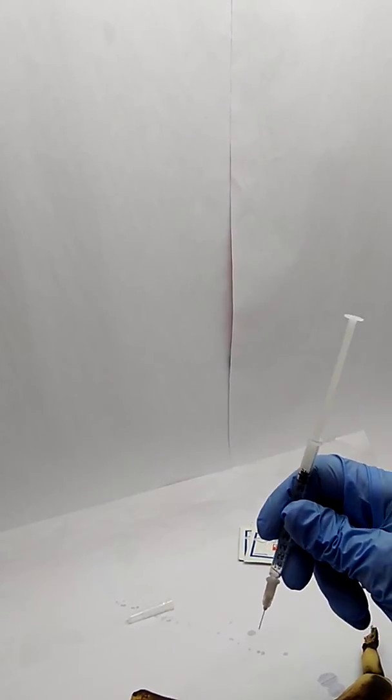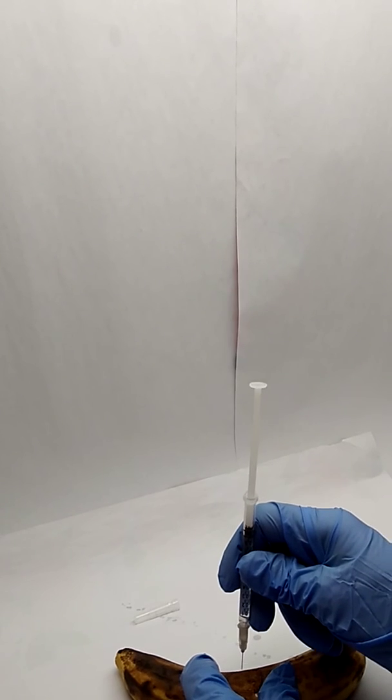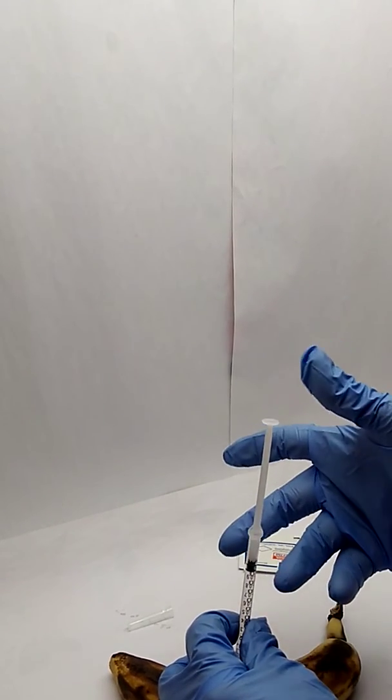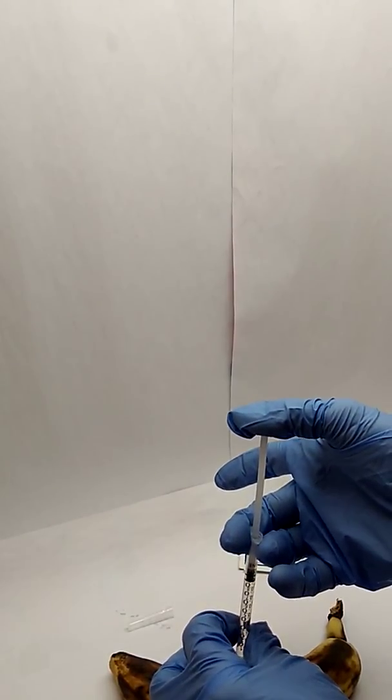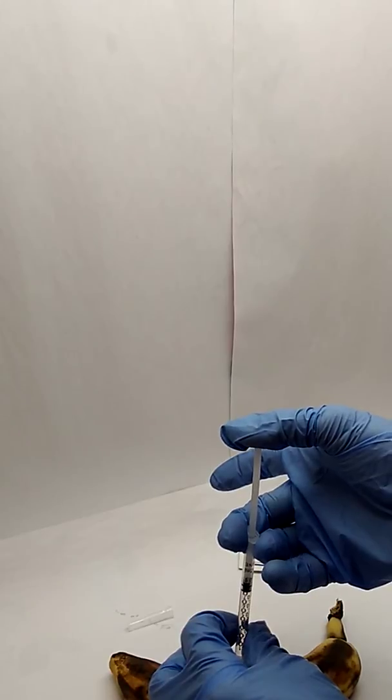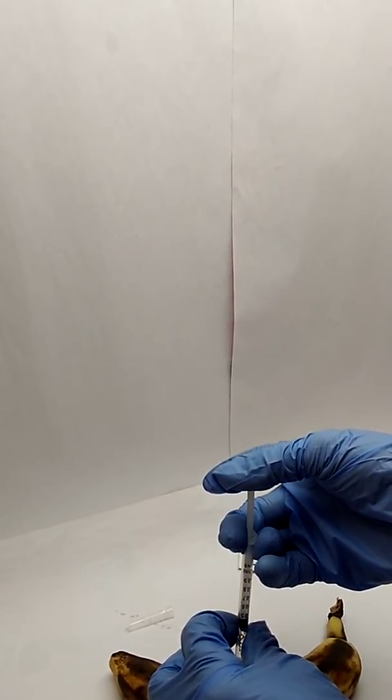Now I'm going to, with my non-dominant hand, pinch up a skin fold, and I'm going to prepare. And so I have this pinched up skin fold. I'm going to inject into that. I'm stabilizing this with my non-dominant hand, making sure I'm not aspirating anything, and injecting the medication and the 0.2 milliliters of air that I drew in.